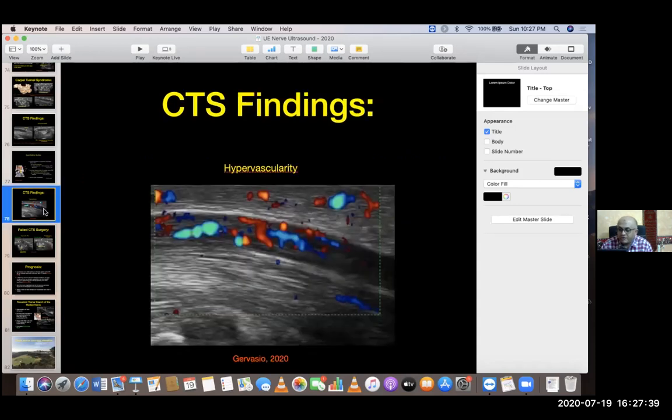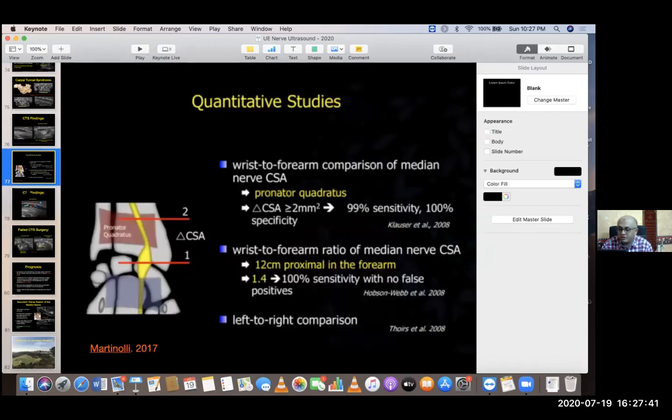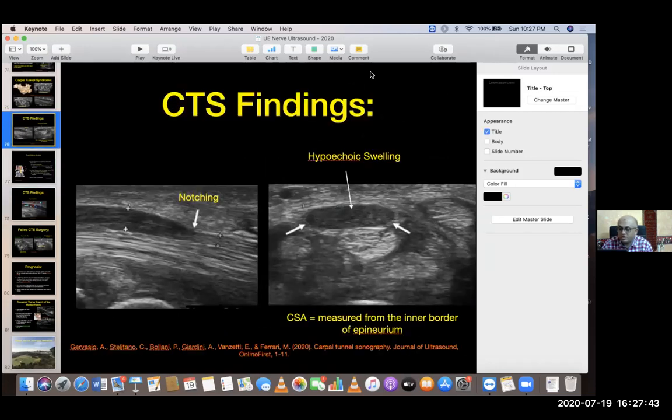Okay. My second question, I will join Dr. Jeff. In neurotmesis, the two end stumps are retracted. So how can we measure the distance between the two stumps to help the surgeon, whether it is filled or not?